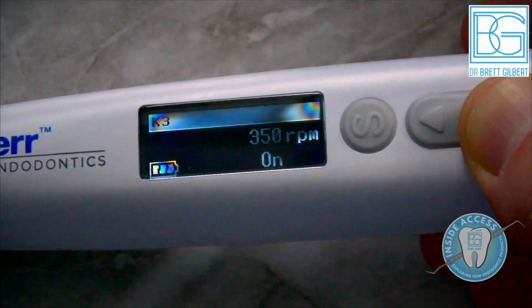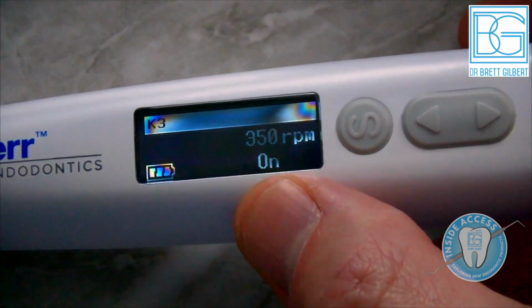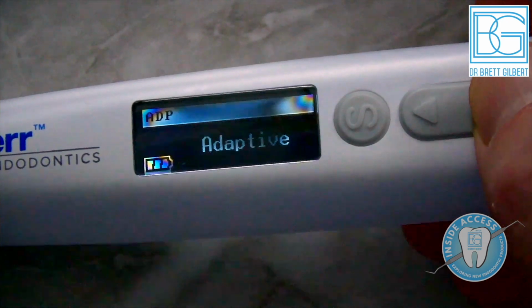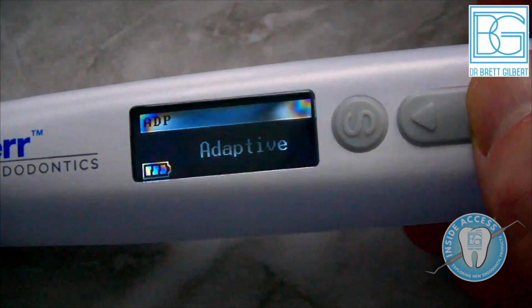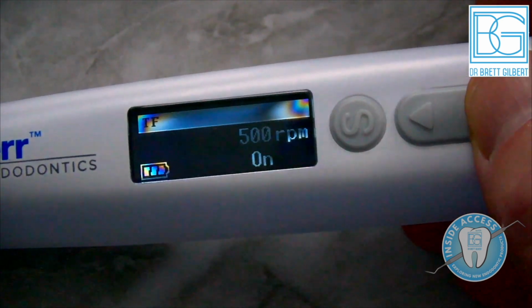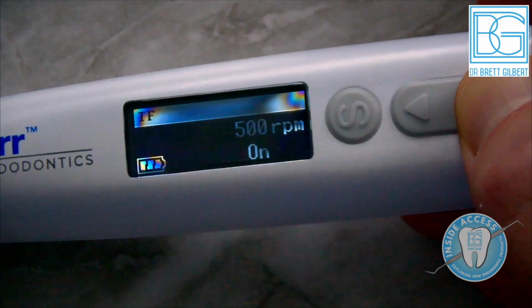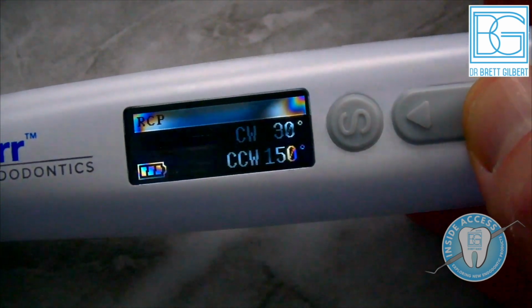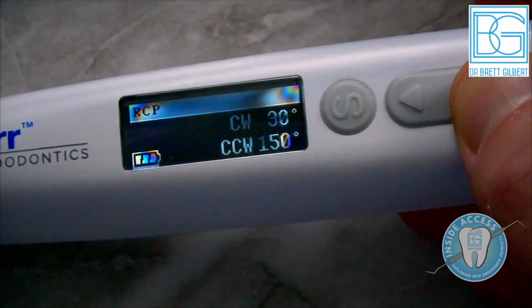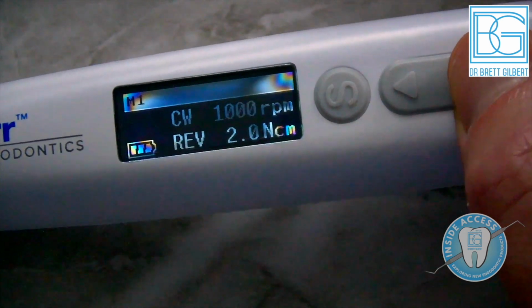Then you get into the K3, and you can see that they're preset, and what you'll see is the on is the torque. The torque is either on or off for the proprietary settings. You have the adaptive functionality, which is full rotation with a reciprocation motion. You have a TF setting, which is straight 500 RPM. Again, the torque just being on or off. They don't want you to be able to over torque their instruments. Now the reciprocation motion is clockwise 30, counterclockwise 150 degrees. This is all preset. And again, the Zenflex 1 are reverse fluted files to accommodate this.